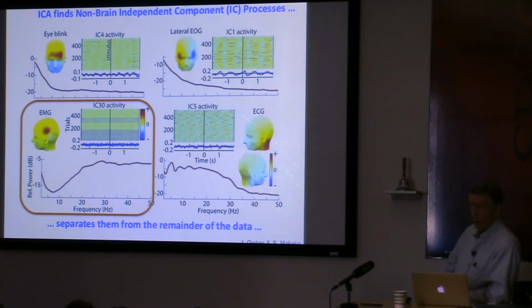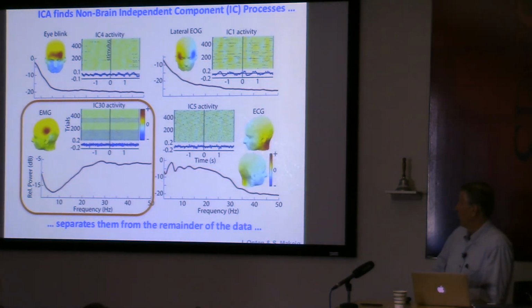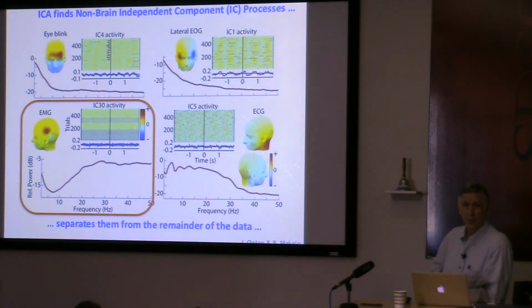Here's a postauricular muscle. I think it's placed too high on the head. This was our first try at co-locating heads and electrodes. And you see the subject was tensing that muscle for the first 200 trials. Then it went quiescent for 100 trials, and then for 50 trials it was active again, and then it went quiescent.